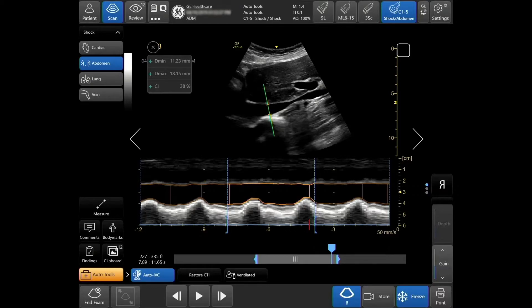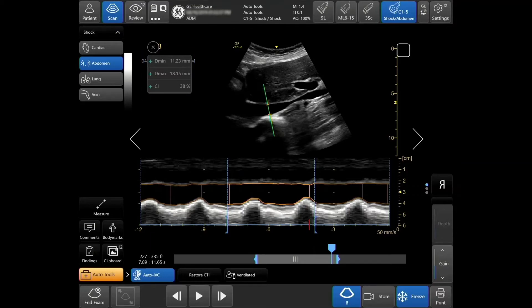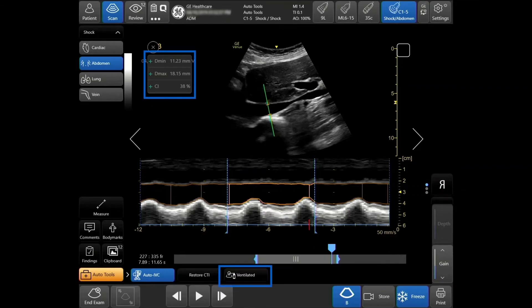Auto IVC will automatically calculate the maximal and minimal respiratory cycle, and your IVC collapsibility will be displayed. For a ventilated patient, tap on ventilated to acquire your distensibility index.